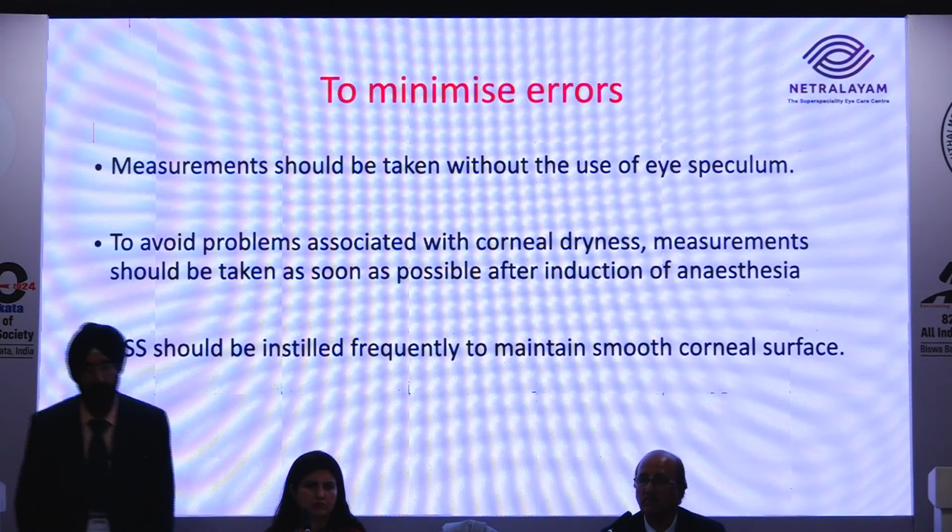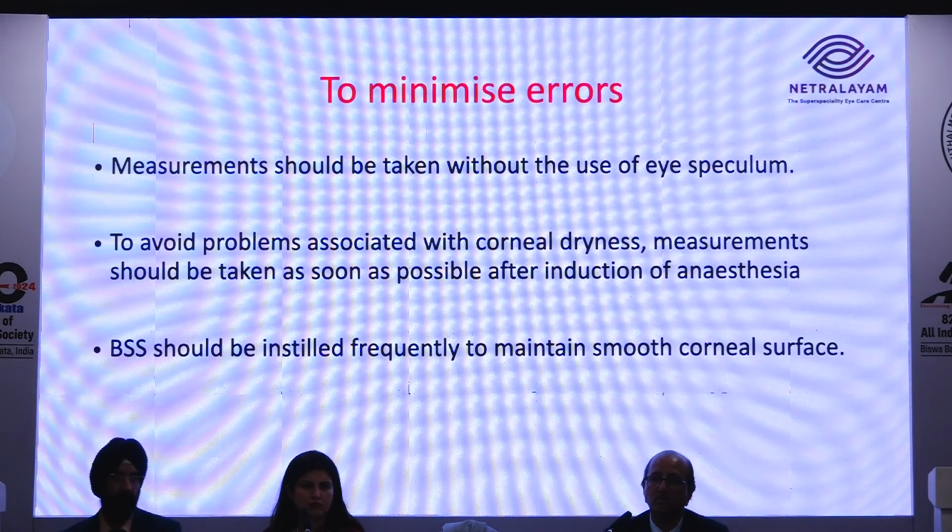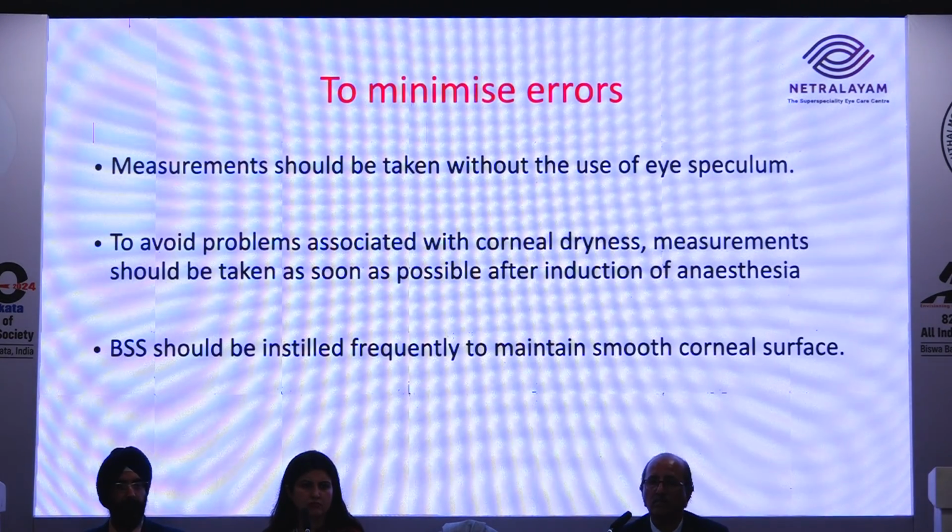To minimize errors, yes, we should not use any speculum. To avoid problems related to corneal dryness, measurement should be taken as soon as possible after induction of anesthesia, and BSS should be instilled frequently to maintain a smooth corneal surface.